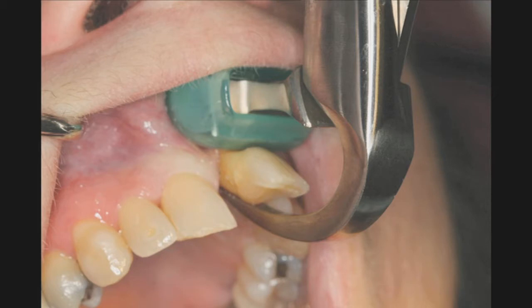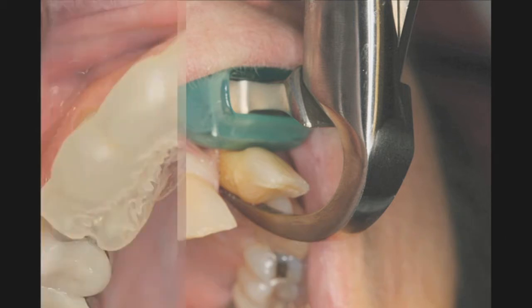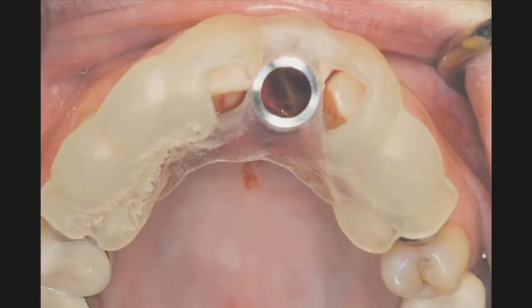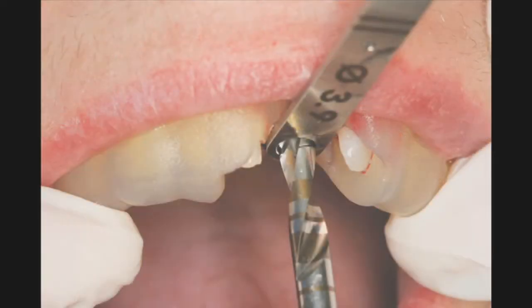The tooth was atraumatically extracted using the incredible physics forceps. And those of you who are not familiar with it, I challenge you to Google golden forceps. It's just a wonderful tool. Figure 8 shows the surgical guide that was again created, positioned, and the appropriate keys would be used to guide the drills during the preparation of the osteotomy. Different size keys are used for different diameter burrs.